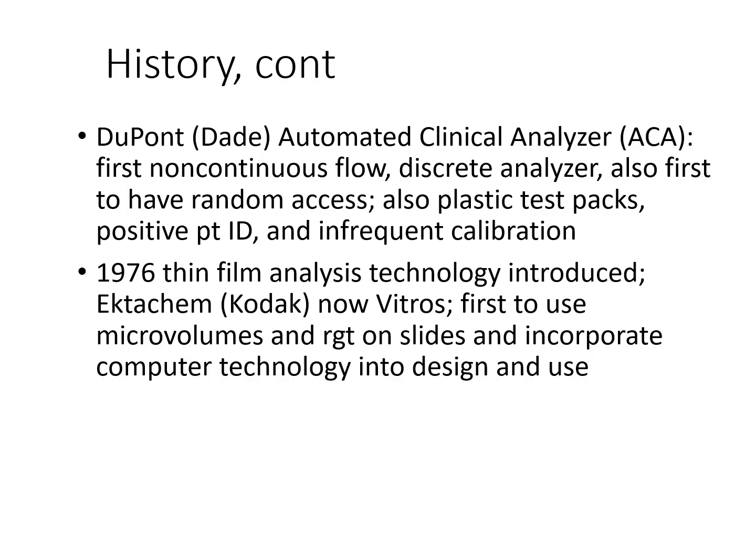Then in 1976, thin film analysis technology came about, and it was introduced by Ektachem, also known as Kodak, but it's now known as Vitros. So first to use micro volumes of sample and reagents on slides. It incorporated computer technology into design and operation.